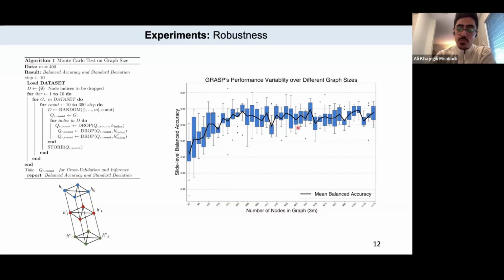So what it means is basically, yes, as we increase the number of nodes, the model gets more stable. But there is a thing here. This plot has an elbow. Basically, after 450 nodes in total, or 150 patches per magnification, you won't get any performance improvement.